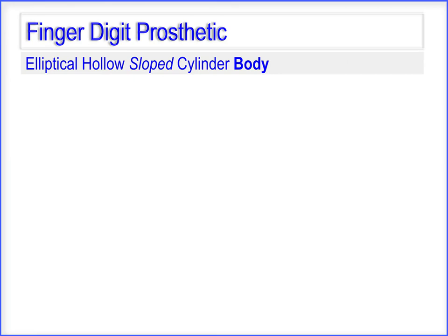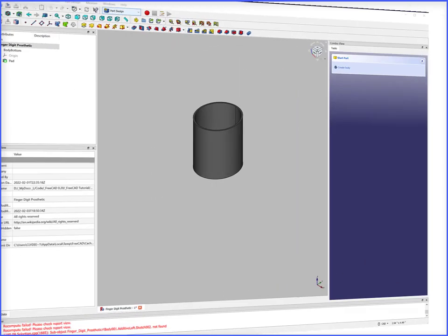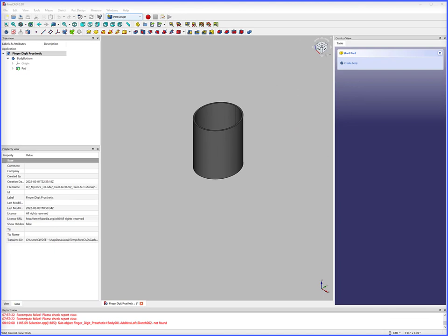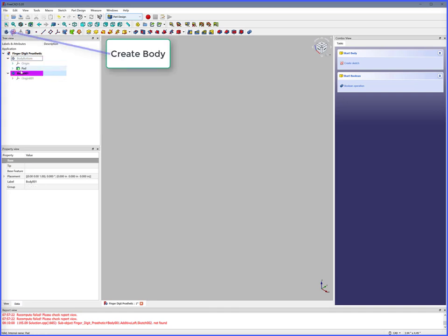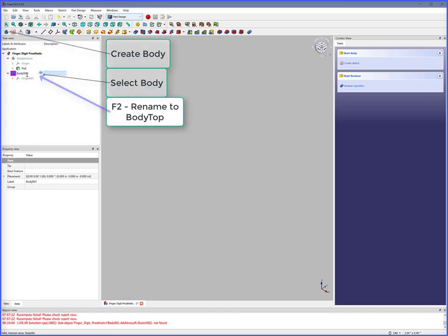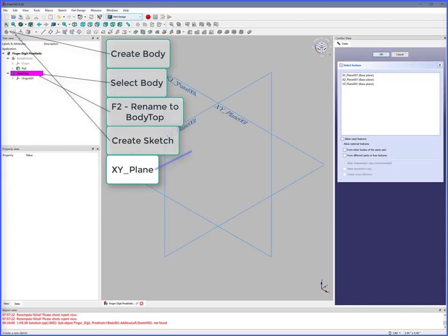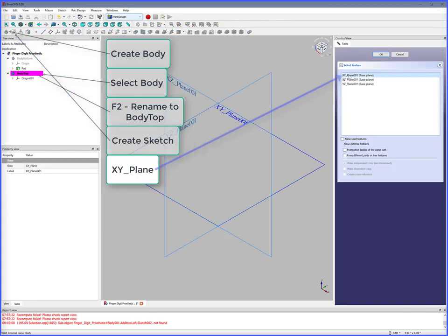We'll continue by creating an elliptical hollow sloped cylinder body. To create an elliptical hollow sloped cylinder, select Body Bottom — spacebar hides Body Bottom. Create Body, Select Body, use F2 to rename to Body Top, Create Sketch, XY Plane, OK.